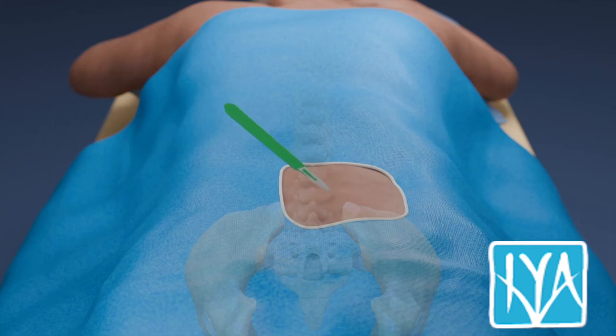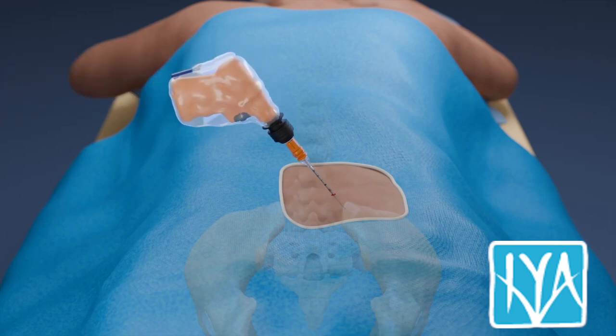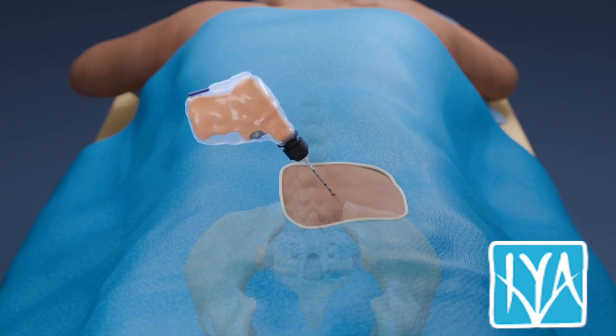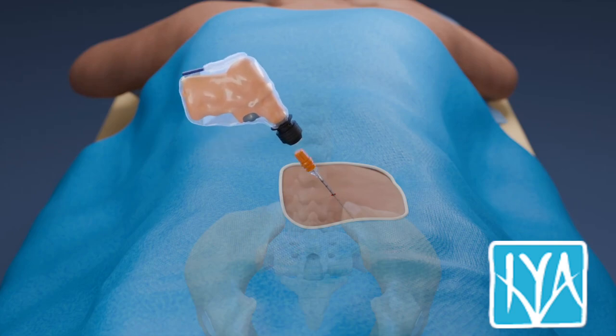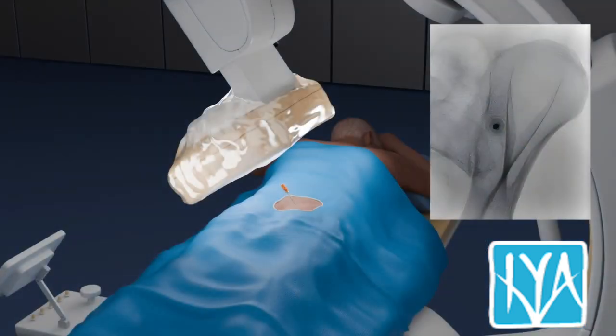After creating a skin nick, a bone biopsy needle is advanced through the skin and soft tissues under real-time fluoroscopic guidance toward the posterior iliac crest. As the needle reaches the bone cortex, it is advanced with gentle rotational movements until it enters the marrow cavity. The live fluoroscopy images help confirm the correct positioning before aspiration.